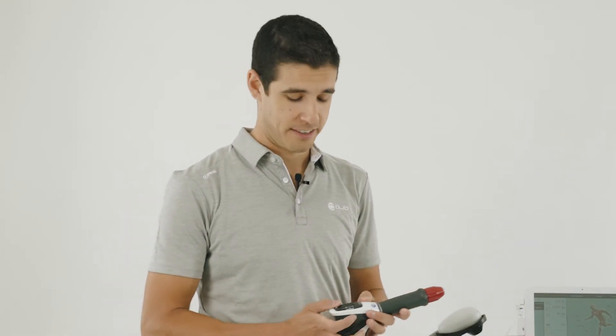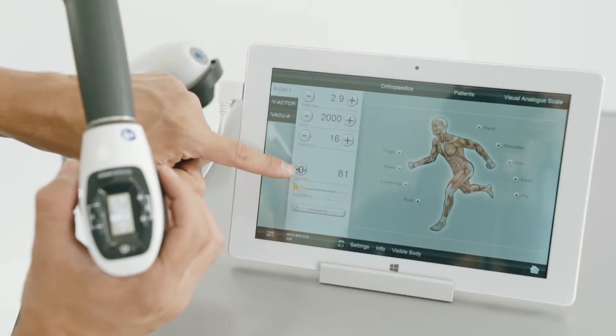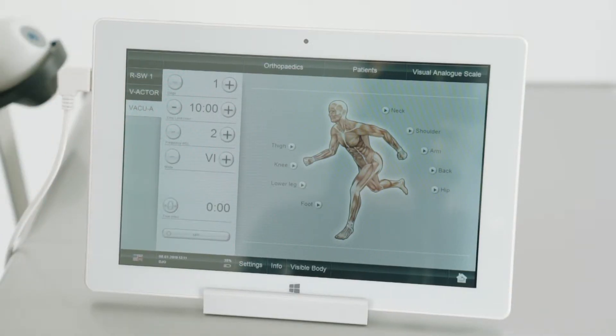To reset the counter, you can press the two minus buttons on the handpiece together, or you can press the zero button on the tablet. To use the different handpieces, simply select the option on the top left of the tablet.